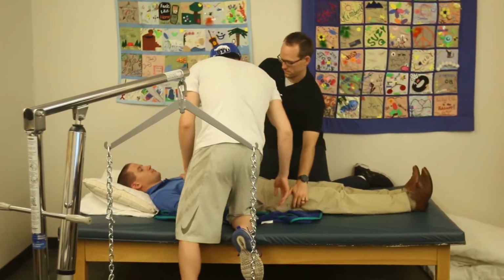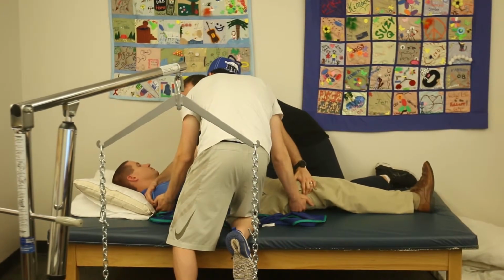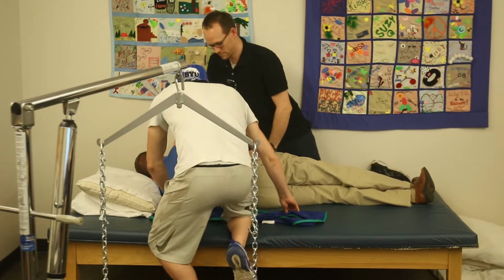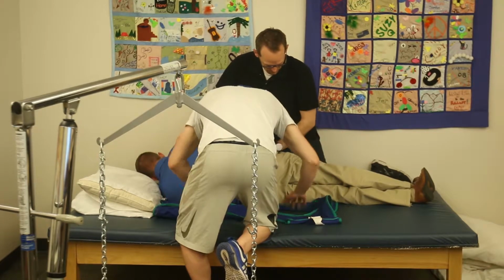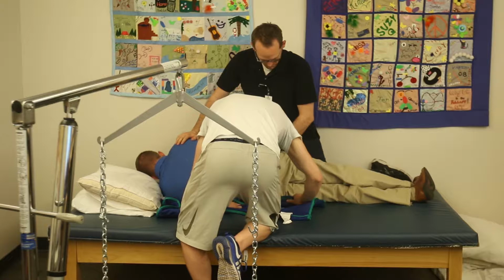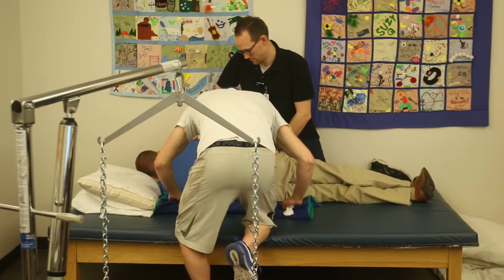So on the count of 3, we're going to place hands on your hips and on your shoulders. On the count of 3, 1, 2, 3. Okay, you feel stable there? Yep. Good. Want to make sure that it's set up good to go.